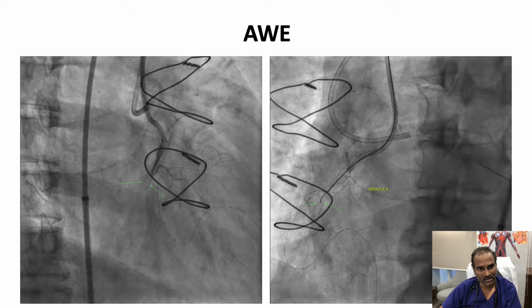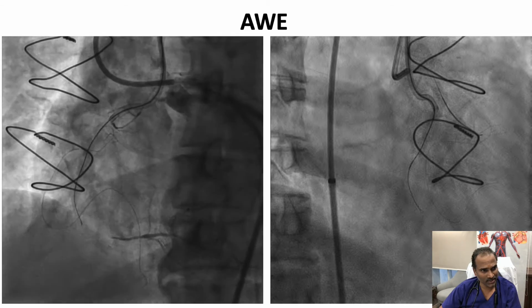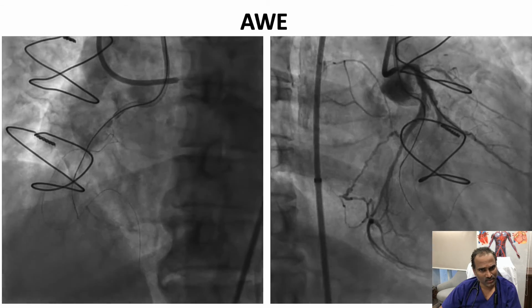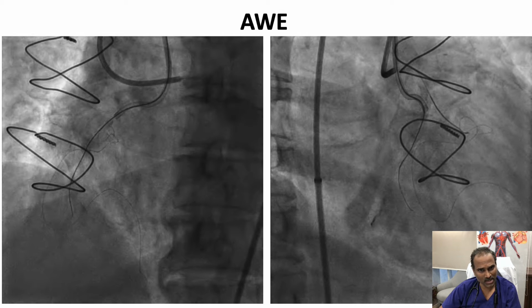It's a Caravel microcatheter with Miracle 6 wire. As there was diffuse calcium throughout, we used Miracle rather than Gaia 2, as Gaia is known to get stuck in calcium. But at this stage, the Miracle wire progressed further into an RV branch. So at this stage, I switched the wire to Gaia after advancing the microcatheter, but even Gaia also went into the RV branch.